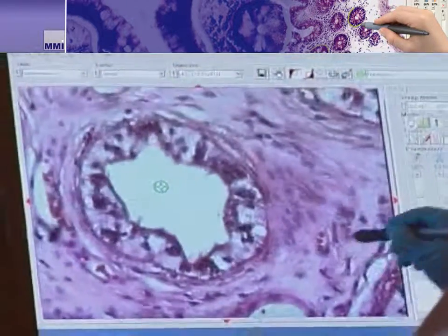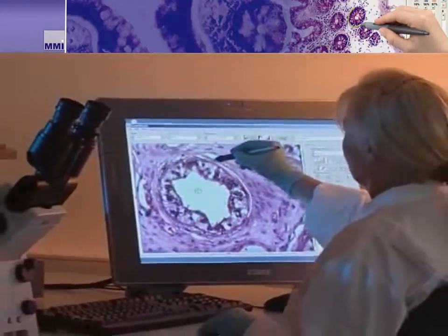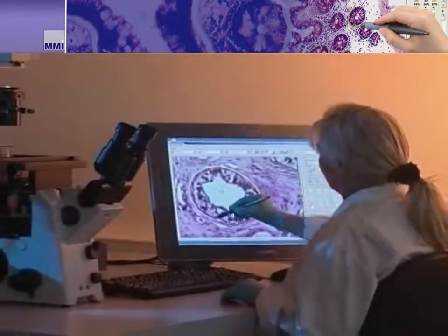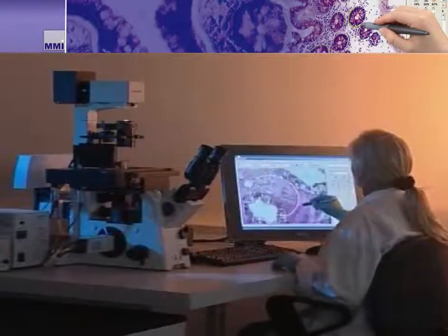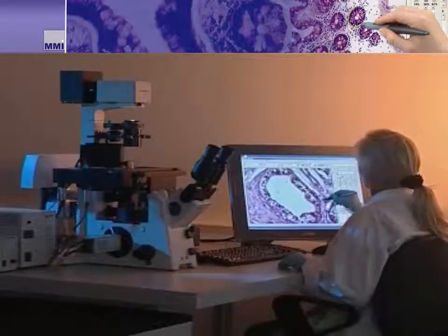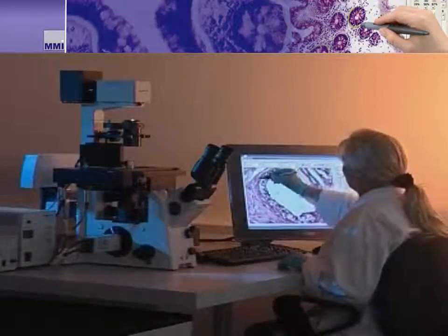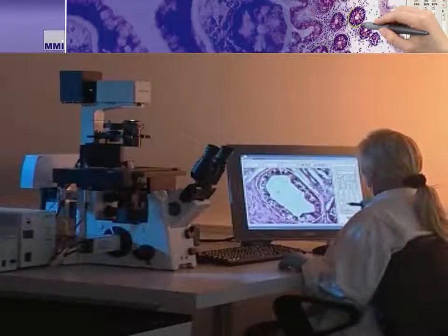In this case, we see an end user using the system's touch screen and light guide pen to navigate the tissue mounted on the microscope stage to her left. We then see her decide on an area and circle it with the pen. You can also use your mouse to do this if you like. The selected area is the area to be cut, and the line she drew is the cutting line the laser will trace.